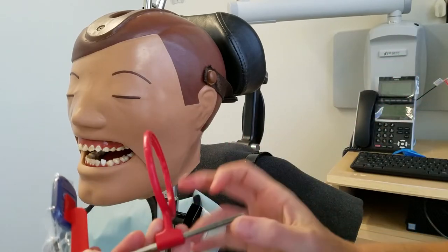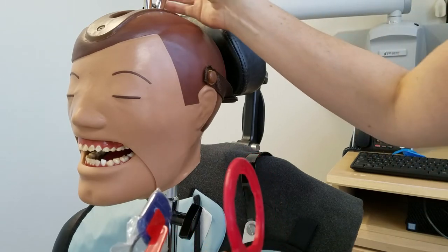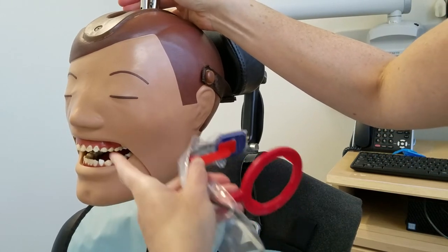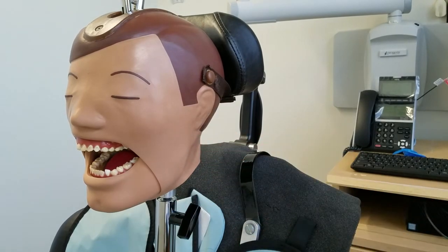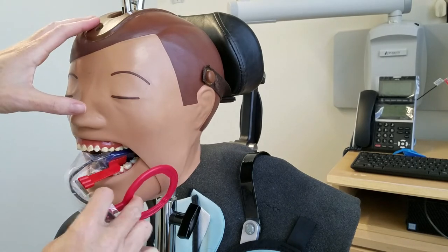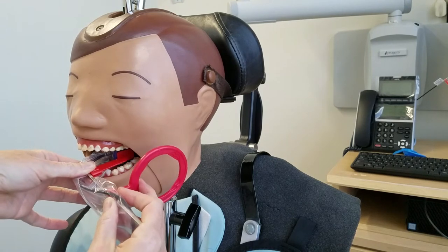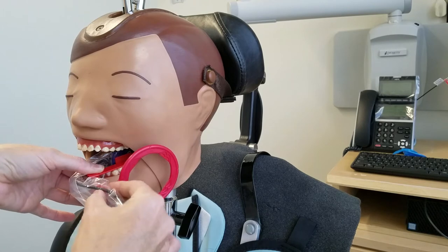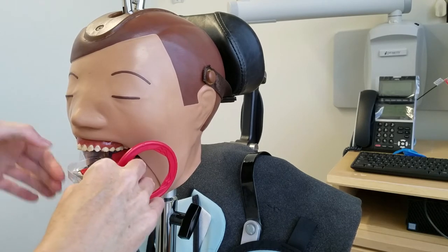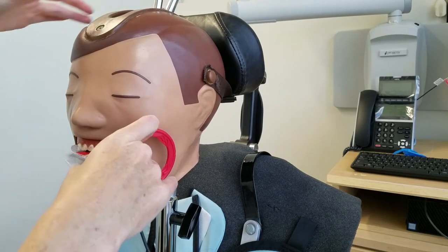I'm going to put in the sensor. For this one, we're going to have the patient bite. We want the second molar to be in the center of the sensor, and then we have the patient bite down.